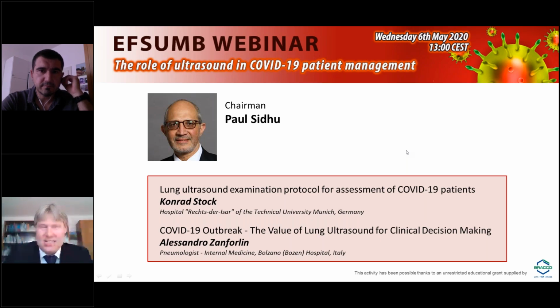The thing is, you can see with contrast enhanced ultrasound, if there's a pneumonia. The big thing about the lung with contrast enhanced ultrasound is that you already have two phases of the lung perfusion. In fact, you can see the embolisms as infarctions in the periphery. And if you've got a pneumonia, you can see the hyperperfused areas, and this is what you really can see as hyperperfusion.